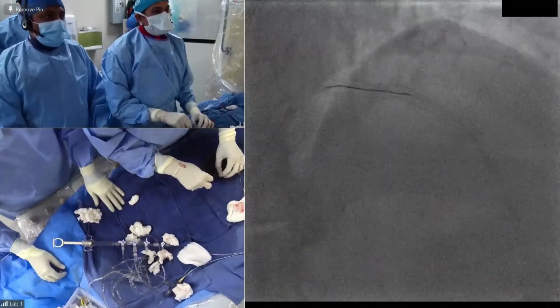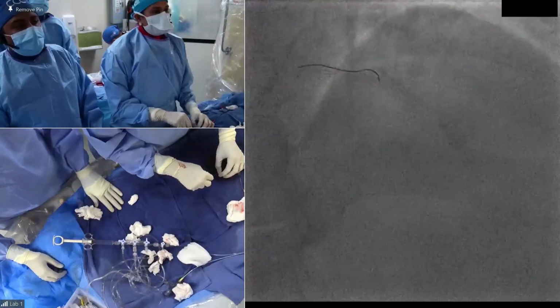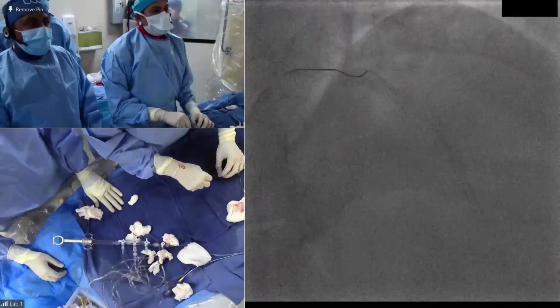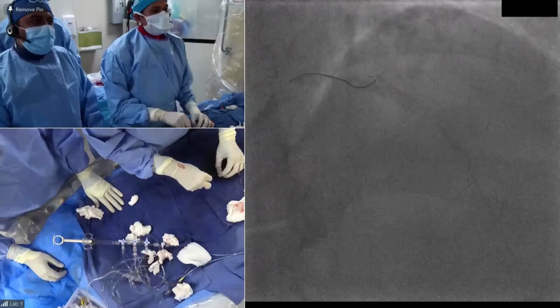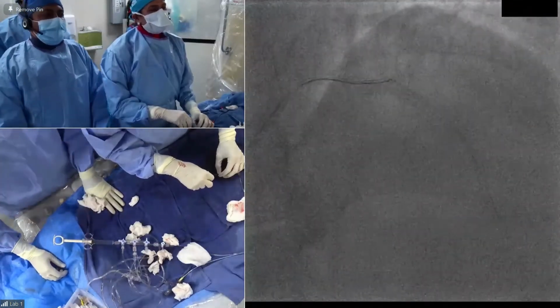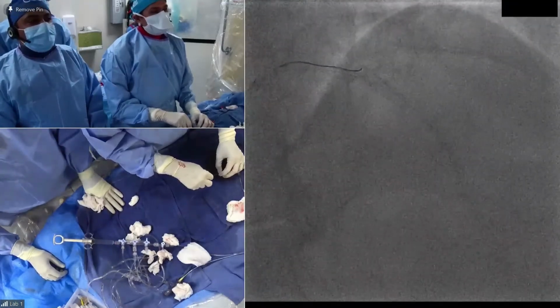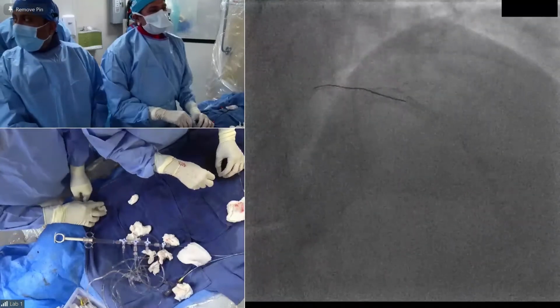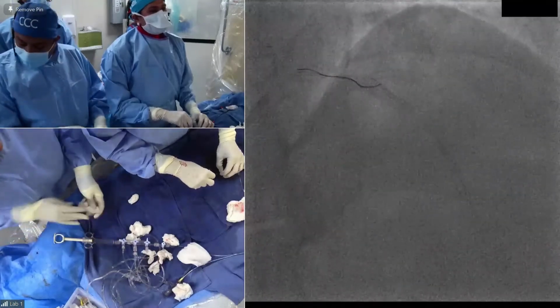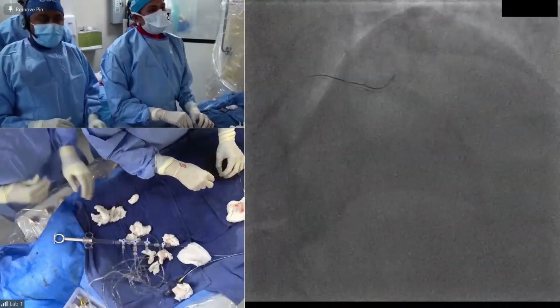There you go. It went in already, but it can't follow. Yeah, I know. This wire has crossed about 4 times already. Can't you get a new wire there at least, as opposed to this banged up 6-times wire? Okay, get us a new wire. Yeah, please get a new wire. It has a little memory. Even if I say don't go, it is trying to go there.